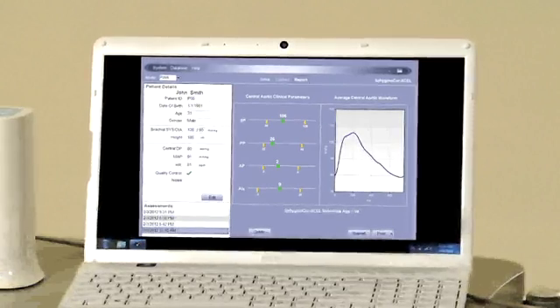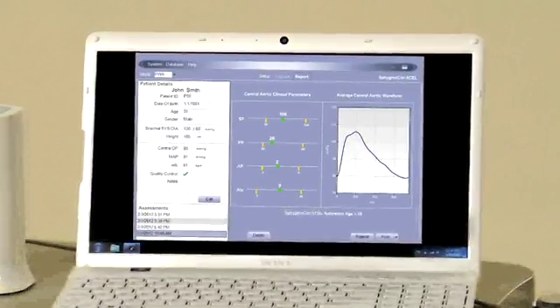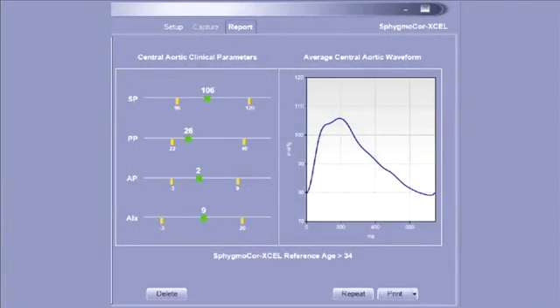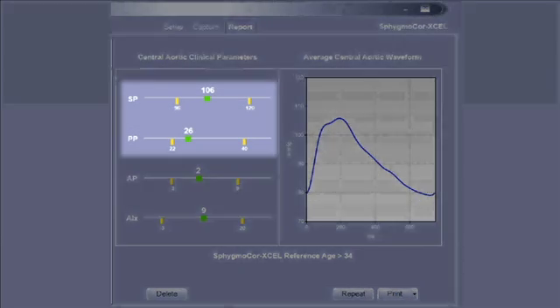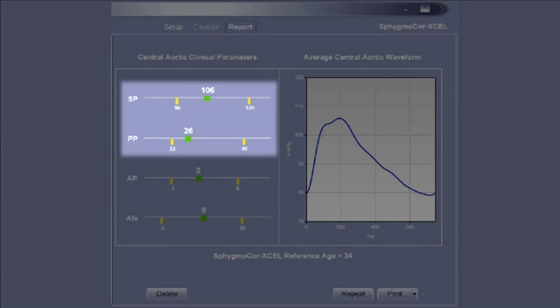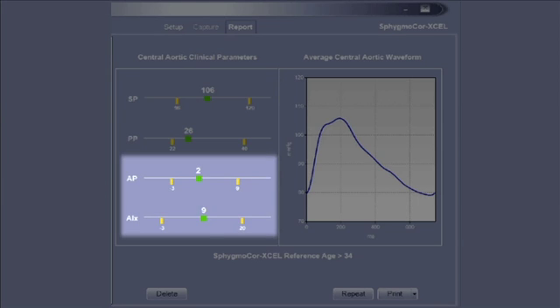After the measurement is completed, the screen displays the measurement results. The patient's measurements will be compared to a reference range based on his or her sex and age. The report screen will show both central aortic pressure and central pulse pressure, which are measurements of blood pressure at the heart, and augmentation pressure and augmentation index, which are measures of arterial stiffness and pressure wave reflection.